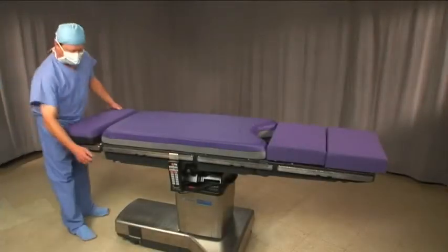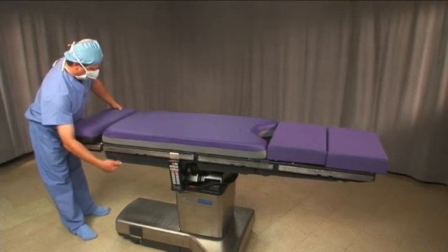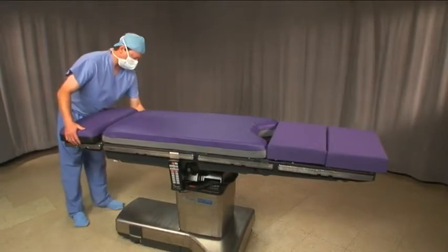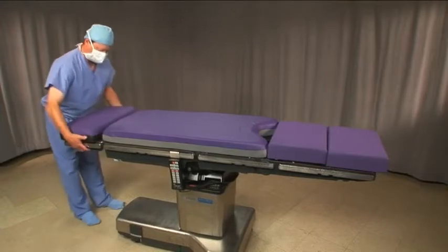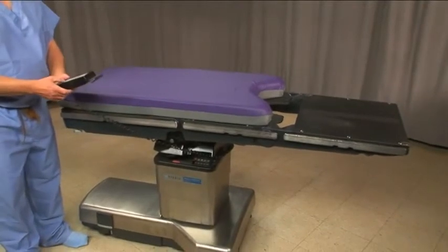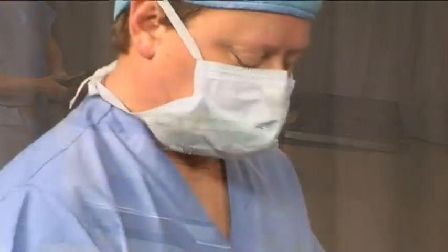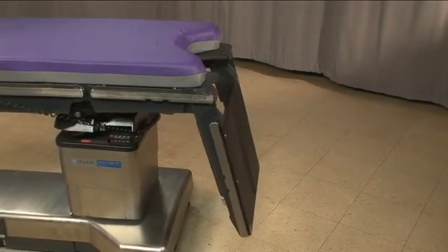Begin by setting up the OR table. Remove the head section and orient it toward where the FlexFrame will be placed. Drop the foot section as far as the table will allow. The FlexFrame should only be attached to the back or seat section of a table, never the head or foot section.